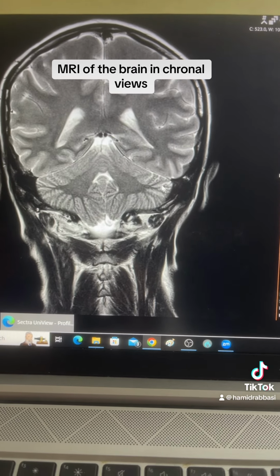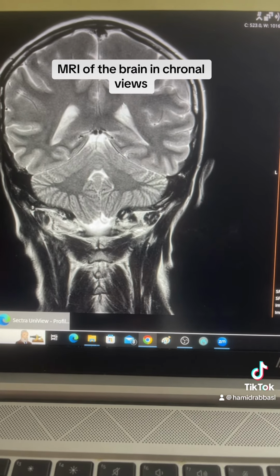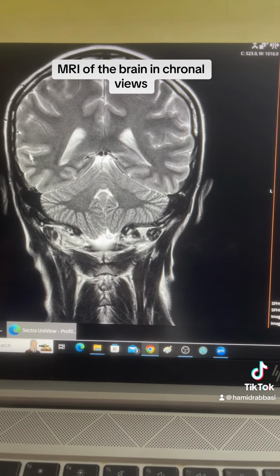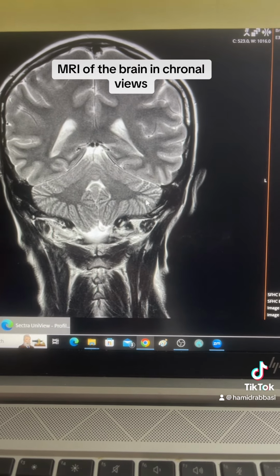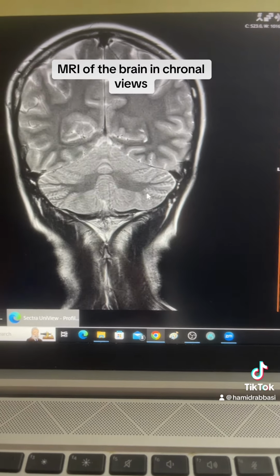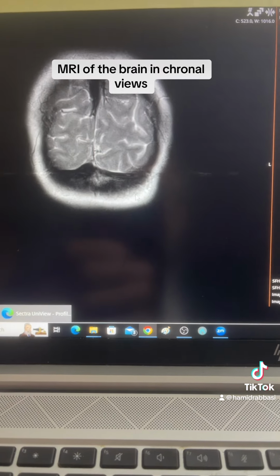See how they are organized so differently from the rest of the brain. This is what is big in mammals. In most animals, the cerebrum or big brain is small, and the cerebellum, you see, coordinates your motion. It's very well organized, and we go from the back of the brain, and here it ends.